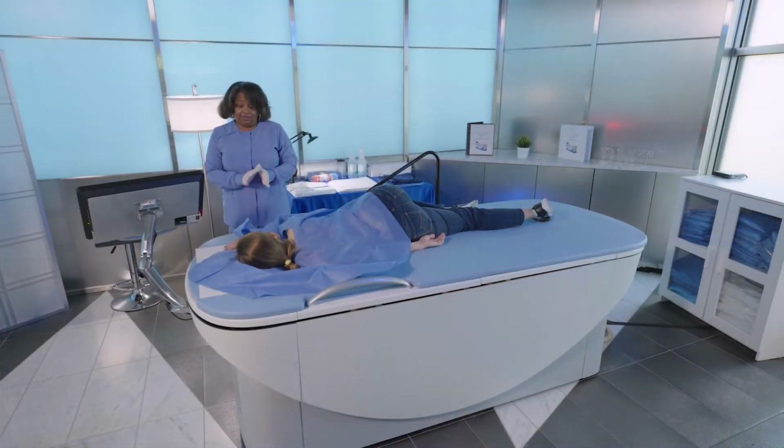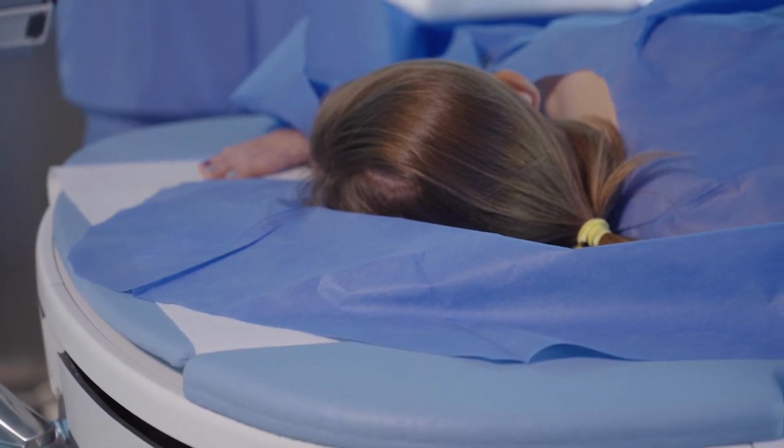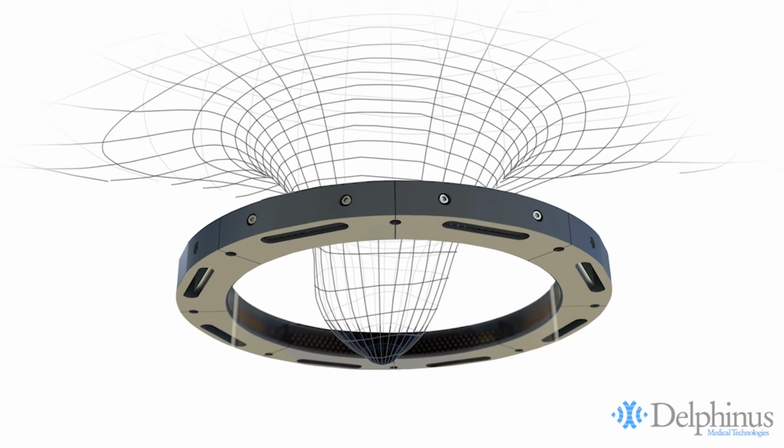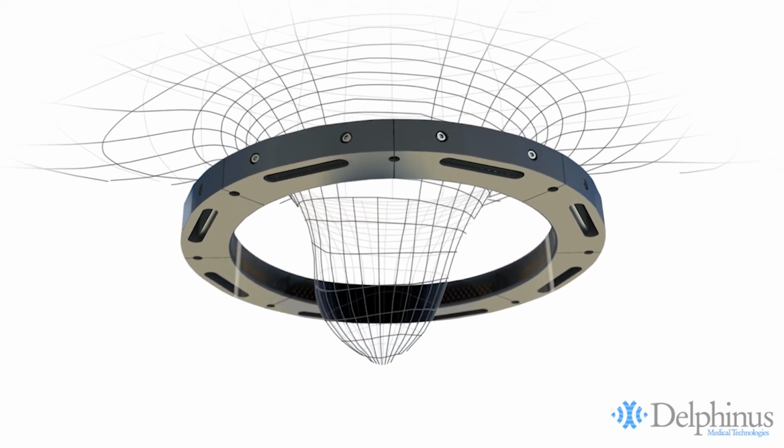Whereas a ring array captures the woman lying still with her breast in water and is able to scan all the way from the nipple all the way up. But it also scans all the way around the breast. Now we get the transmission signals. We get to see a mass from all sides, not just from the skin surface. We also get to see it going through the deep part of the breast, where a lot of times even regular reflection ultrasound has difficulties penetrating deep in the breast, especially with somebody with dense breast.